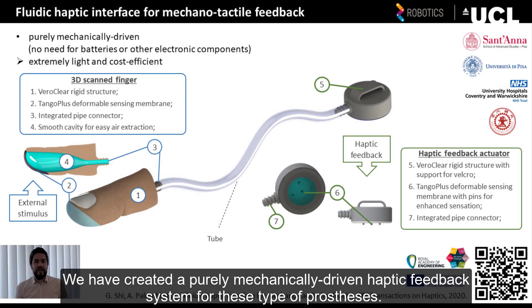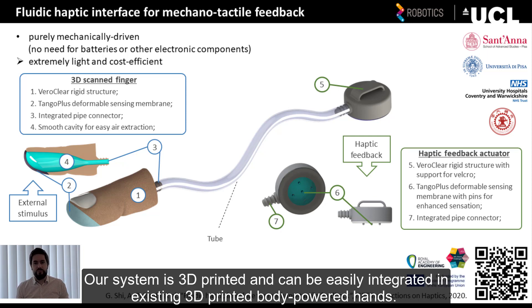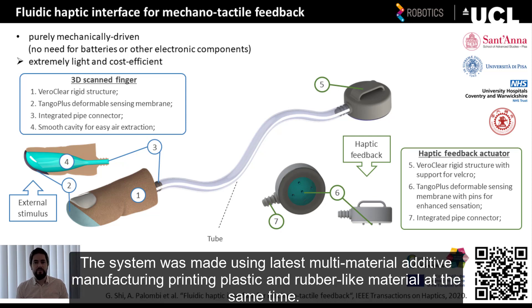We at UCL, together with our collaborators, have created a purely mechanically-driven haptic feedback system for these type of prosthesis. Our system is 3D-printed and can be easily integrated in existing 3D-printed, body-powered hands. The system is made using latest multi-material additive manufacturing, printing plastic and rubber-like material at the same time.